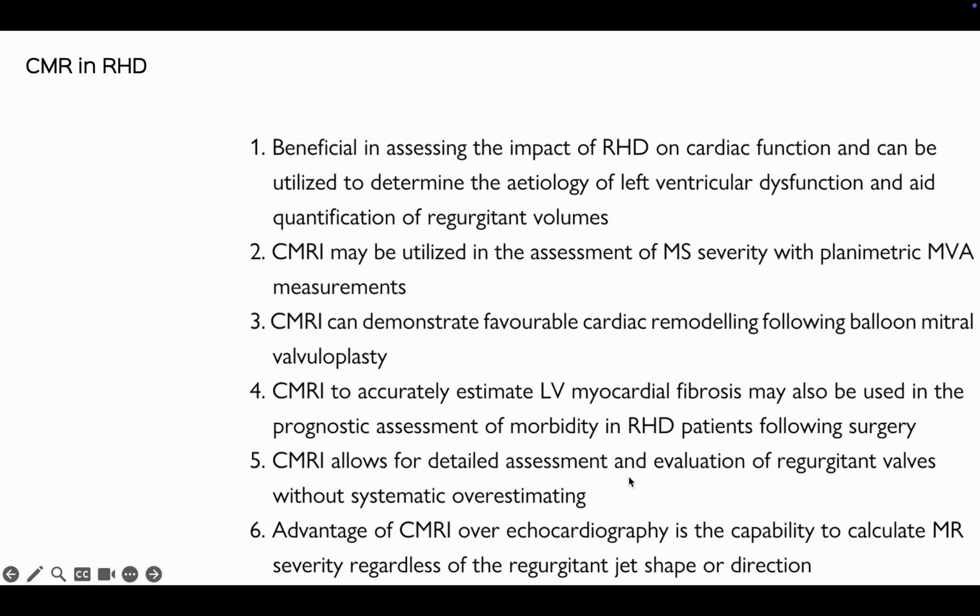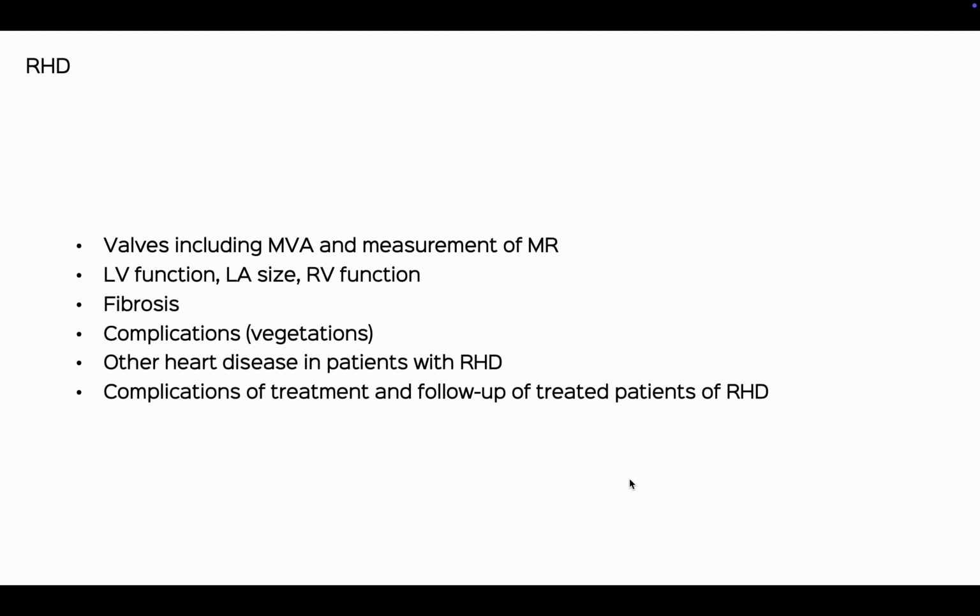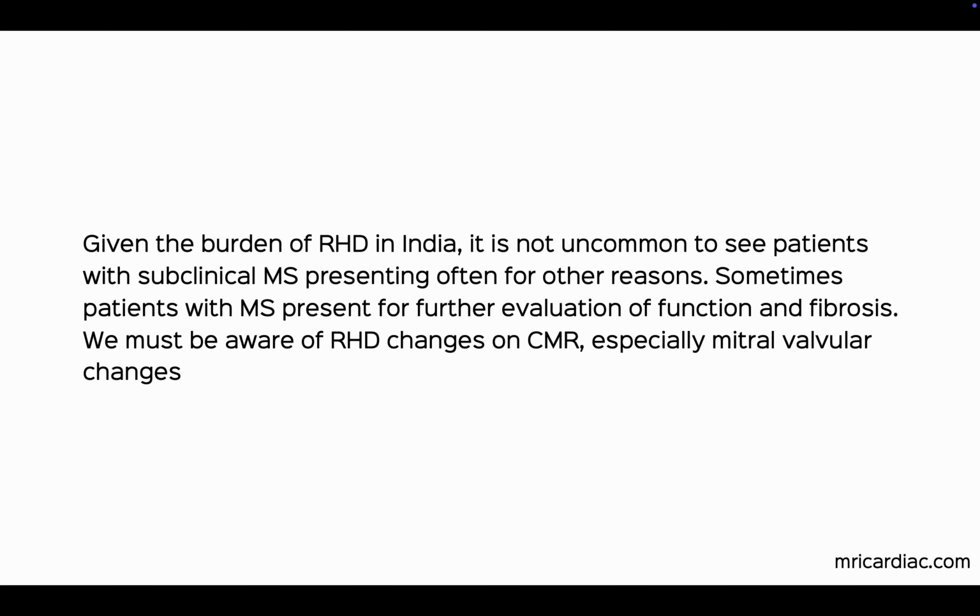So these are all the indications for CMR in rheumatic heart disease summarized in that same article I talked about. And there's more as well because you have complications and other heart disease, etc. And this is the post I'm going to do next month as well. And I was going through my archives, and we have at least about 20 odd patients of MS or rheumatic heart disease that we've scanned for a variety of reasons. Many of them post valvuloplasty, but that's fine. We just look at them as well.